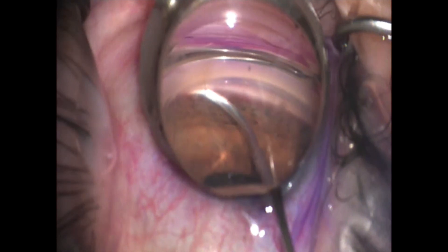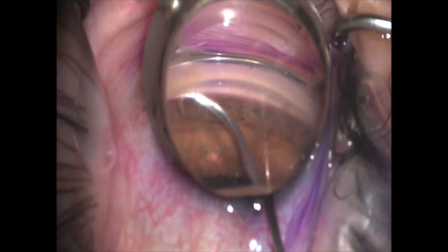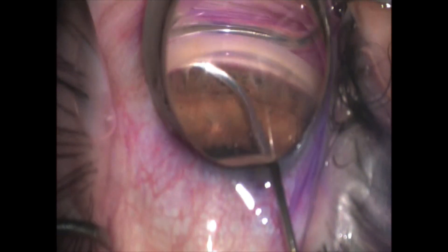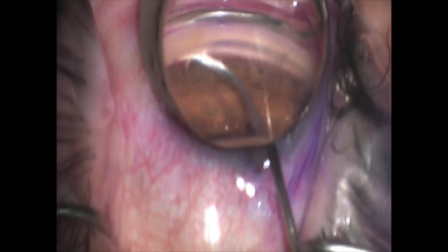This device you roll down forward with the trigger and push down on the button at the same time, so this puts all the control in the surgeon's hands. Every time you push down on the little button it injects the viscoelastic, releasing approximately three microliters per pump.